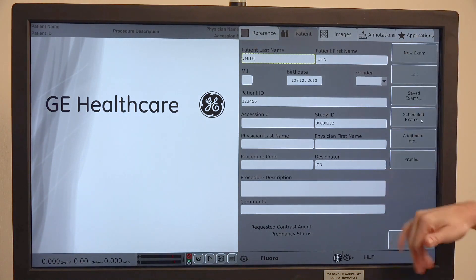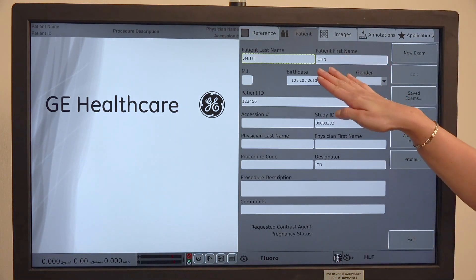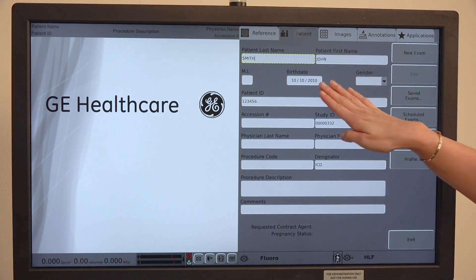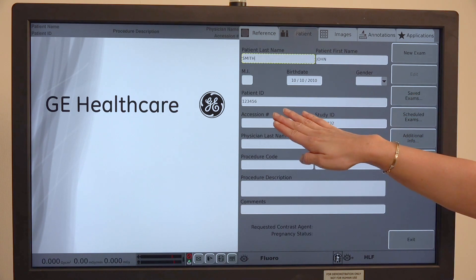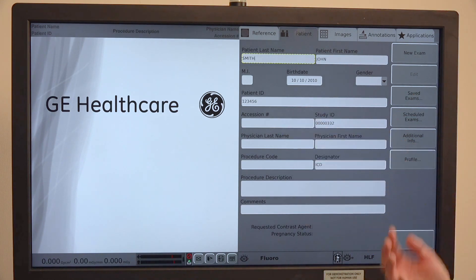It's going to create a new exam for John Smith and it's going to hold his same name, date of birth, and patient ID that was already entered in previously.